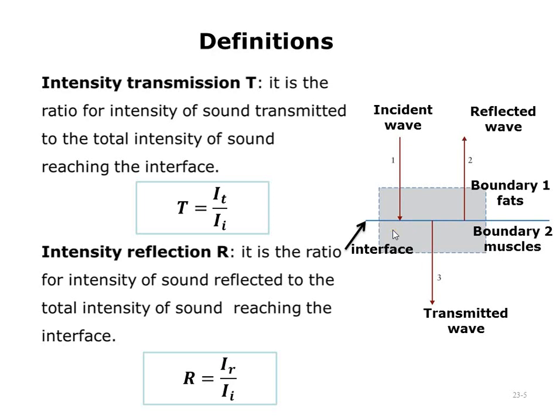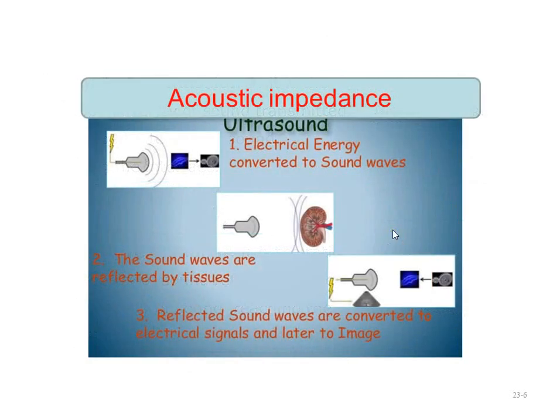Of course, as we know, in the case of sonar in submarines, or bats or dolphins, they all send an ultrasound wave to the surroundings. Then the ultrasound wave is reflected back, carrying information about what is in front of and around the submarines or bats or dolphins. Here also we use the same idea but using a transducer. This is a device that emits ultrasound and also detects ultrasound.